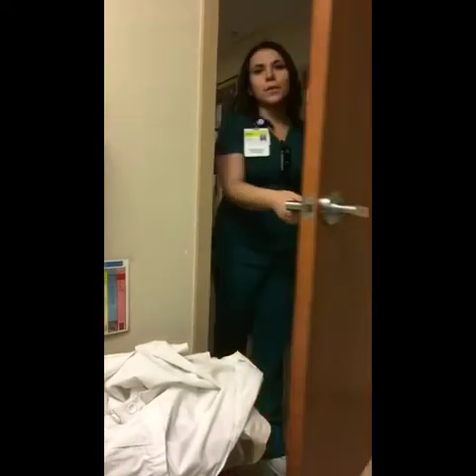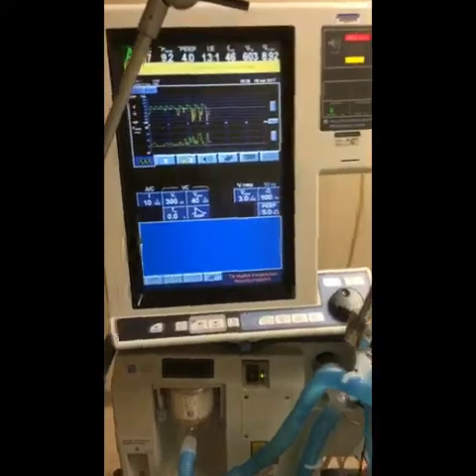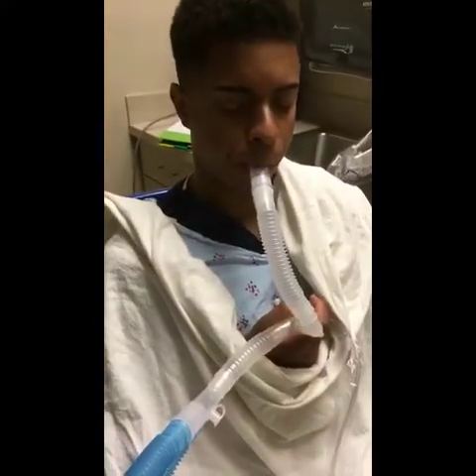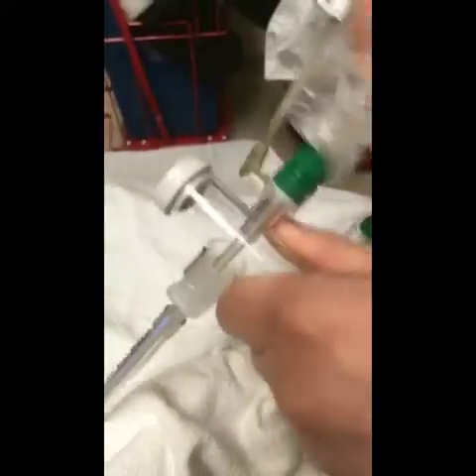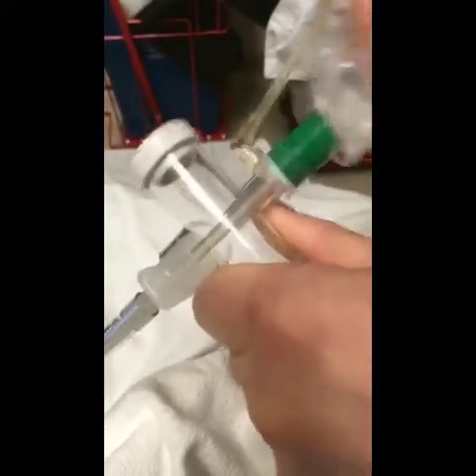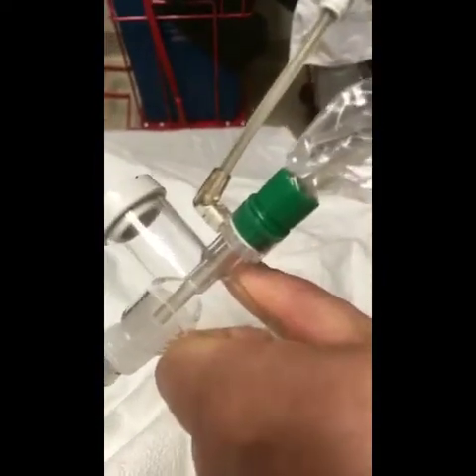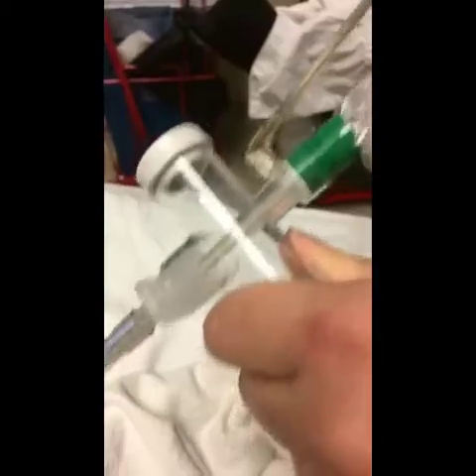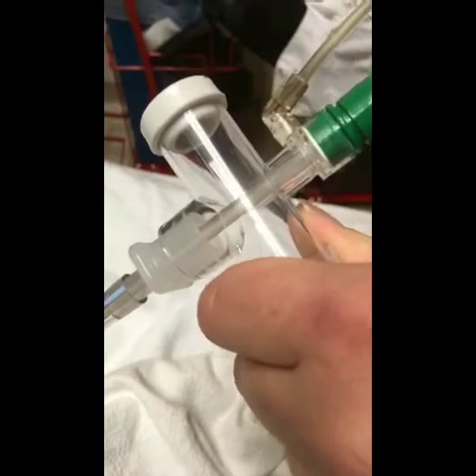Can you come to room 323? The vent won't stop alarming. So what's going on? I just turned him over to give him a bath and the alarm won't stop going off. Oh, okay. Let's try to suction it. Oh yeah, he's full of secretions. Oh, I can't get the catheter to go down any farther. He might have a mucus plug.